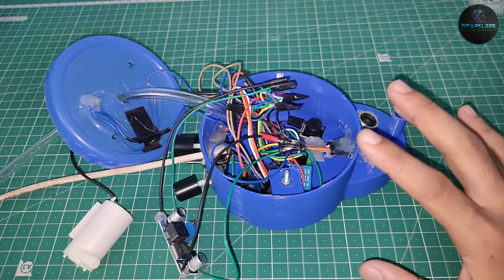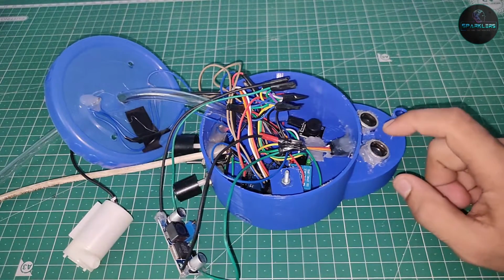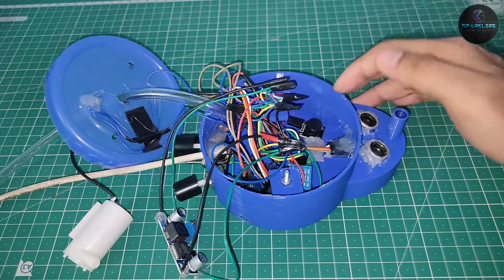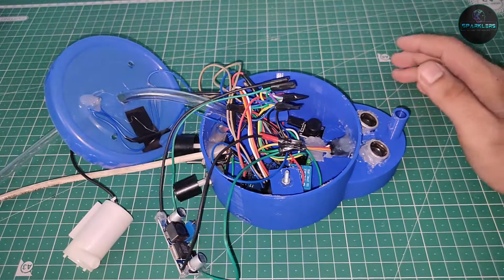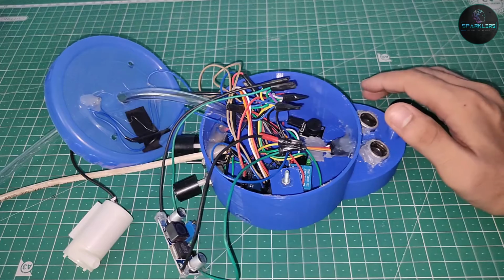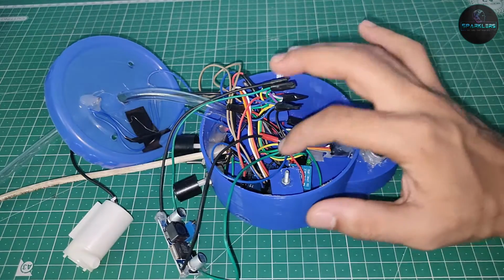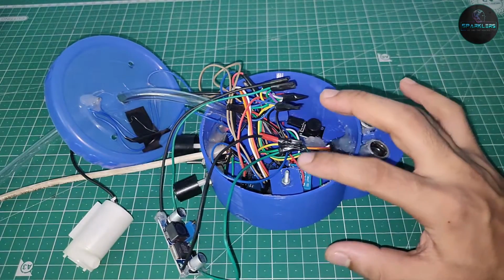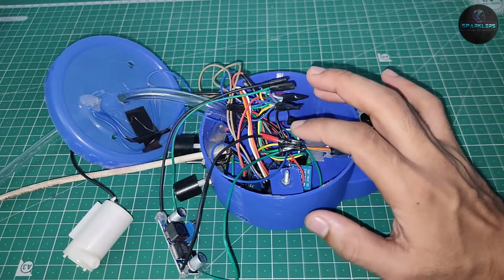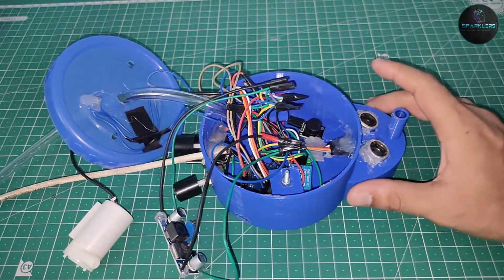Now if you are using 5 volts, you can power every component in the whole thing with that 5 volts. Using that 5 volts, you can power this ultrasonic sensor, the relay, the pump, the buzzer, and the LEDs. You can power everything with that 5 volts easily. But if you are using 12 volts, what you need to do is give that 12 volts to the Arduino V-in pin, because the Arduino V-in pin supports 7 volts to 12 volts. Here I'm using an Arduino Nano, but it's the same for other Arduinos. Then in the Arduino there is a 5-volt pin, so from that 5-volt pin you can take the output and give it to all these components. So if you are using 12 volts, you do that.